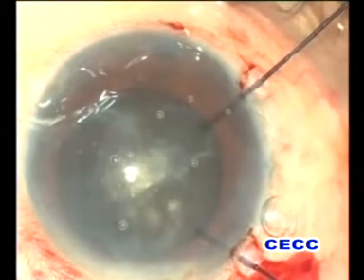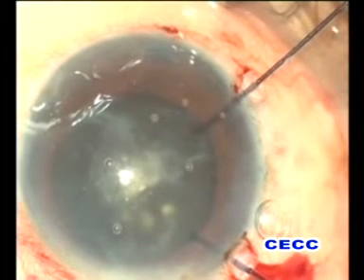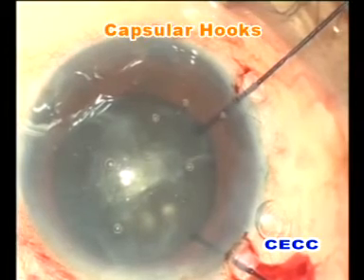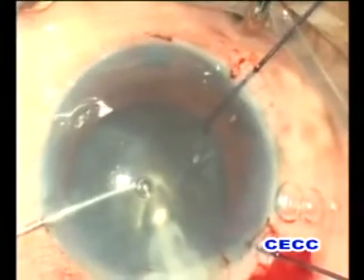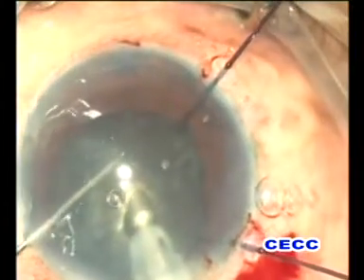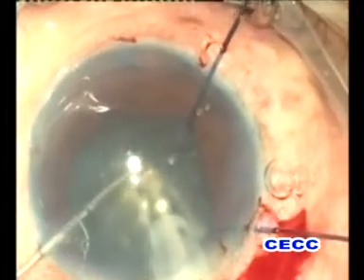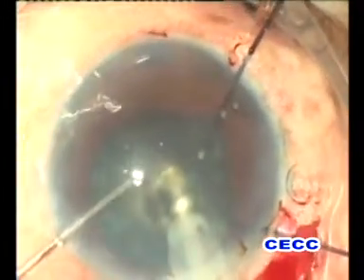So the surgeon shifted superiorly, abandoning the temporal clear corneal incision site. A fresh scleral tunnel incision was designed. The capsular bag was stabilized with two capsular hooks placed in the area of zonular dehiscence. After an initial deep well was created, we proceeded with a direct phaco chop technique. The nucleus was chopped into multiple small pieces using a Chang chopper with a 2 mm tip.